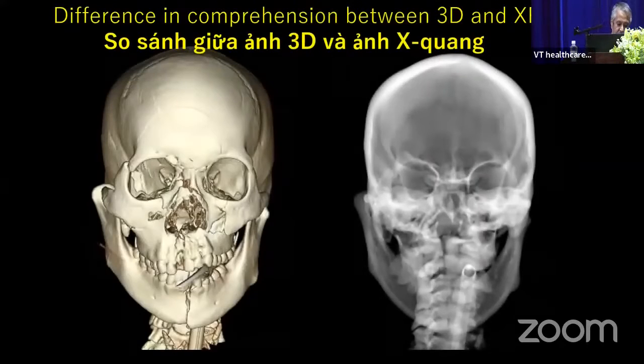Also, 3D CT can understand the fracture of the facial bone. It is almost impossible to understand the fracture part on the X-ray image because other bone overlaps in front.